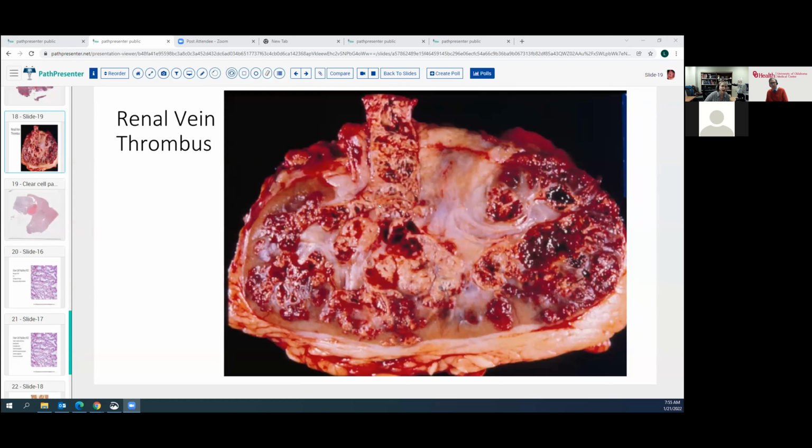So I've only seen this once, and how we caught it was that the Urovysion FISH was positive, and they went back to the urine and pulled it. These patients now are being caught so much sooner than they were historically when the Urovysion FISH was developed. But the cells, when they exfoliate into the urine, are usually very degenerated. So they will still have larger nuclei than the normal benign urothelial cells, but it can be very hard to distinguish.